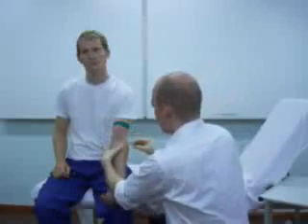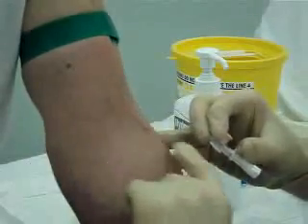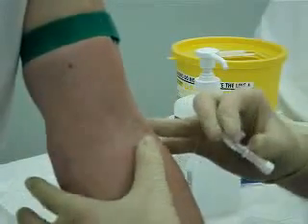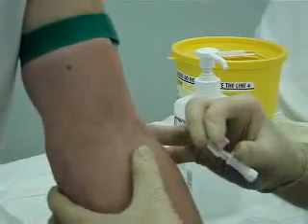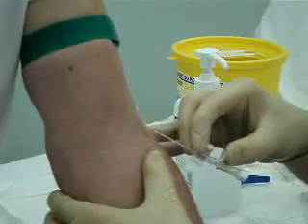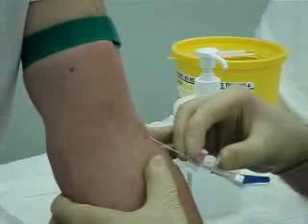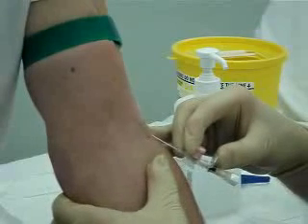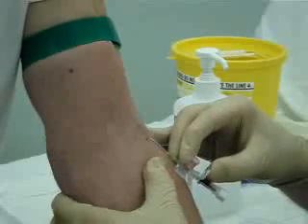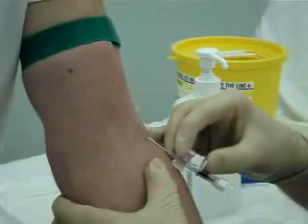You're just going to feel a sharp scratch in just a second. So when I'm approaching the vein, I've got the line of the vein clearly described. I'm going to just tighten the skin slightly using my ring finger and thumb. Again, I'm not touching anywhere near the actual insertion site. And then once I've got the line correct, at about 30 degrees, I'm just going to gently and firmly insert the cannula in. You can see there straight away, just gone through the skin, the flashback into the bevel of the cannula. At this stage, drop the cannula down nice and flat, and then insert it maybe a millimetre or so.